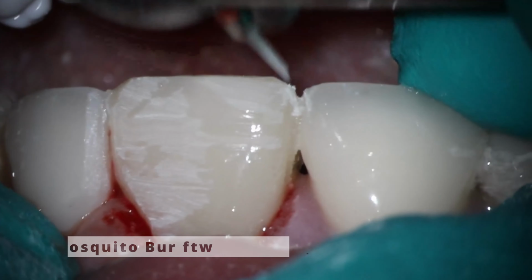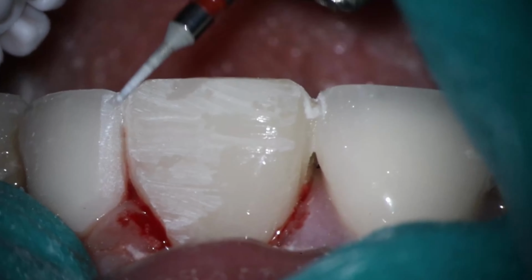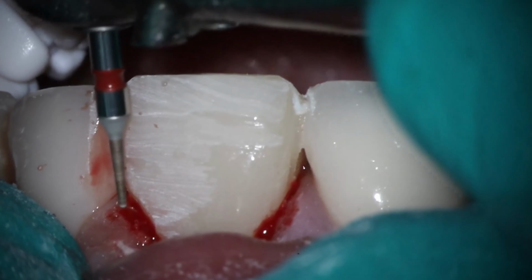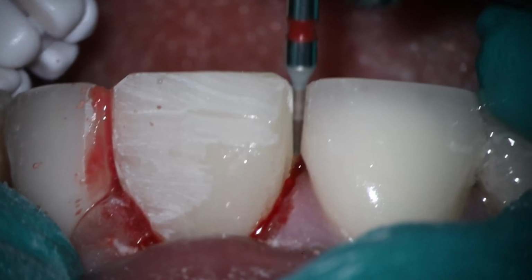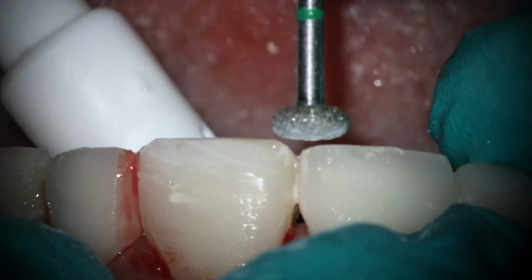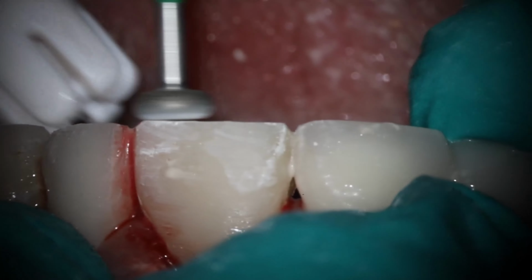And then my favorite burr of all time, the cute little mosquito burr. This thing is so stinking useful when it comes to shaping anterior teeth. This isn't really that zoomed in as far as the video; this is about what my eyes see. I like to do a lot of the fine detail work at about 16 times magnification, and that's what you're seeing here. It just really does create beautiful embrasures.